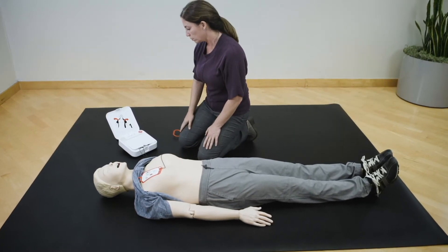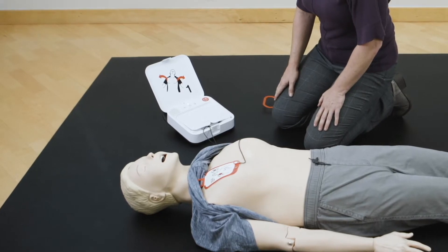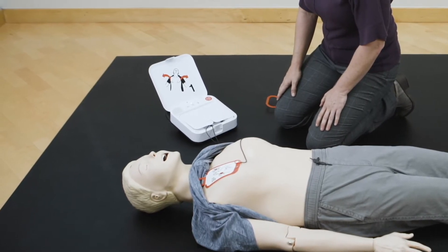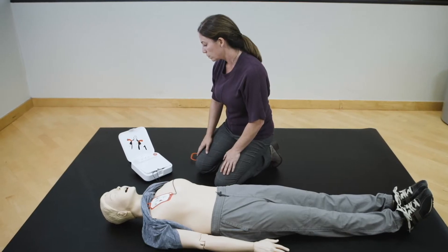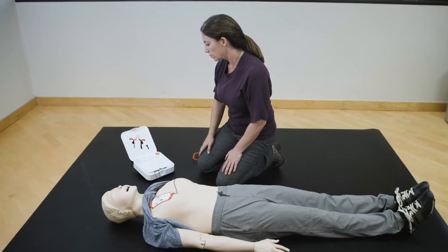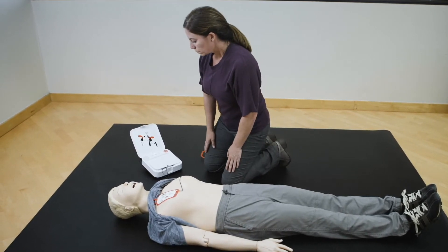Do not touch patient. Analyzing heart rhythm. Everyone clear. Do not touch patient. Delivering shock. Shock delivered.